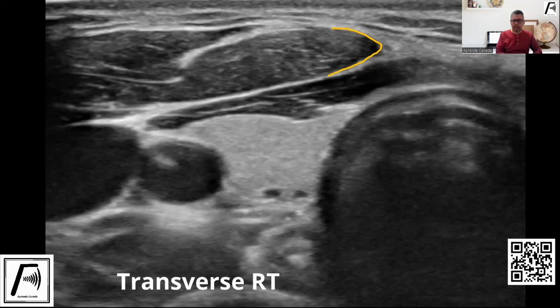See what you think. Like I said, nowadays, with the advance of compound imaging on most machines, this is not a huge problem, but I have still noticed it, even though compound imaging is on. So something to be aware of for those novice sonographers out there, so you don't think that it's an abnormality, it's just another artifact.